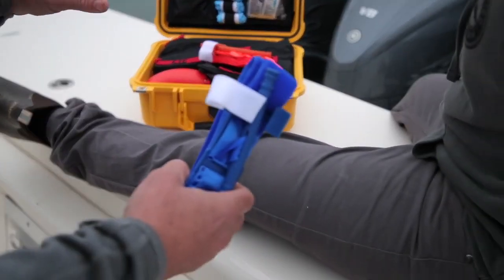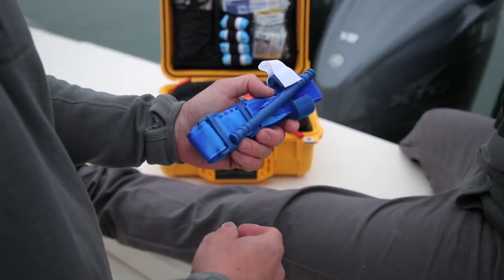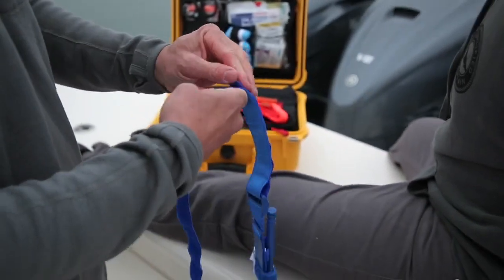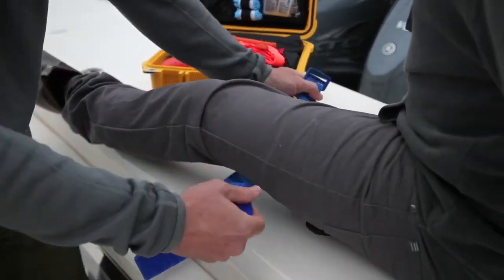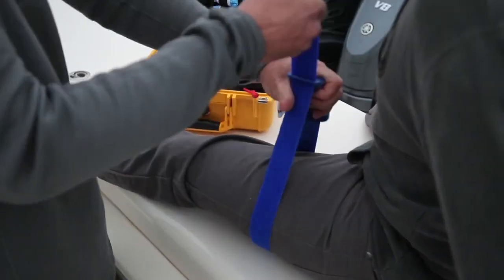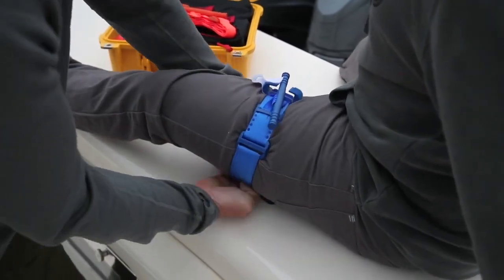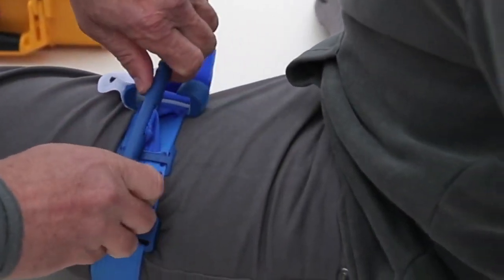We want to demonstrate a lower extremity or leg application of your tourniquet. A simple scenario could be a prop injury, a shark bite, or any sort of injury to your lower extremity — and we want to stop bleeding fast. Take your tourniquet, open it up and take it out of the retention buckle. Slide it under his leg, bringing it up through, making sure there's nothing — if he's wearing pants — in his pocket. Cinch this down as tight as you can, bring the strap back around, and now utilize the windlass.